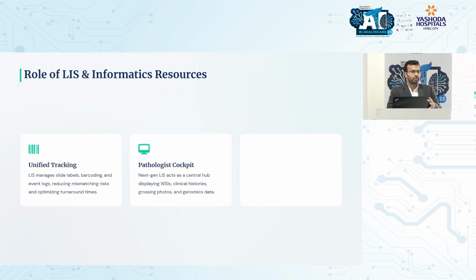Now your pathologist cockpit, basically, it's not just one screen, it's two screens. One screen which shows you all the information, gross photographs, LIS information, clinical history, everything. And the other one is your actual whole slide image where you can view and decide and type out your report.